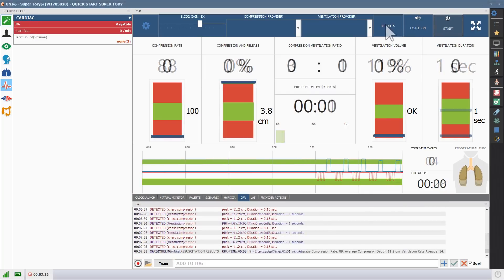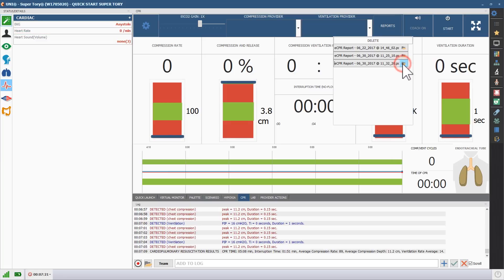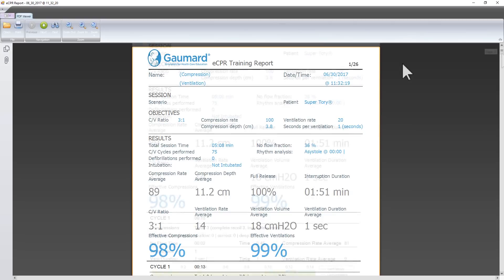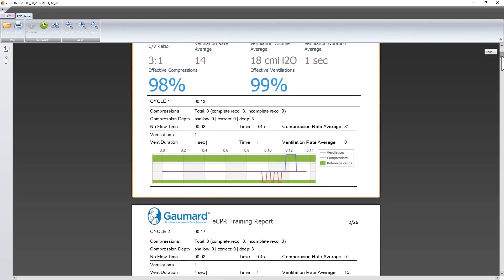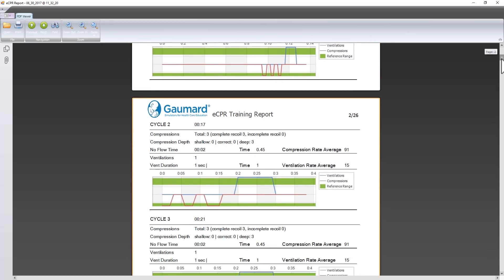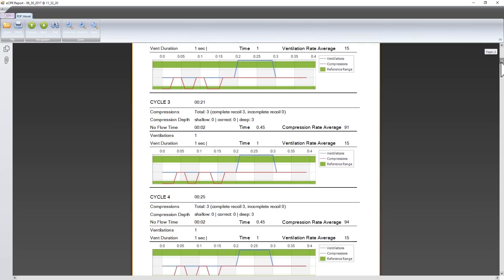After the CPR session, click Stop and click the Reports button to open a library of CPR reports. The eCPR report lists the target parameters at the top and the averages for each category below. Each cycle of compressions and ventilations will also be broken down independently.